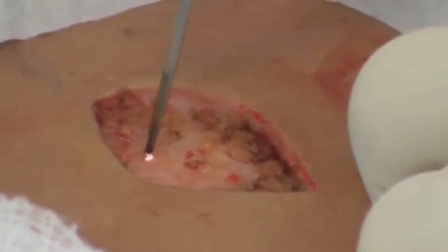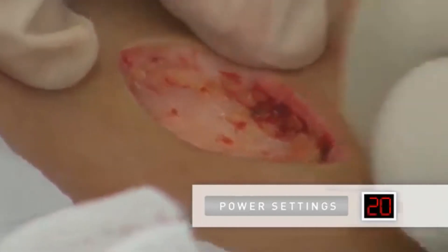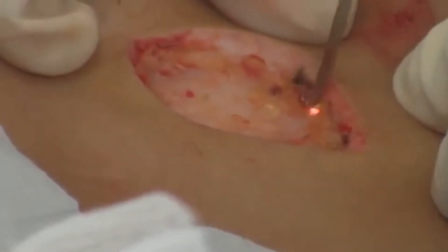Using the ARIN 940 high-frequency desiccator by Bovee and an A804 sharp dermal tip electrode, any of the bleeding points resulting from the tissue excision are cauterized. With a power setting from 15 to 20 watts, you can see how quickly and effectively the ARIN 940 accomplishes the hemostasis.